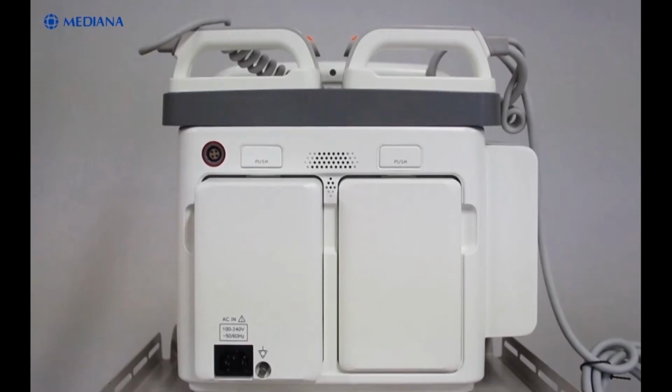Now we will go through the power supplies and how to use them. You have 3 different types of power supply: AC power, DC power, and battery. First of all, for the AC power, make sure that the AC outlet is properly grounded and supplies the specified voltage and frequency. After you plug the male-type connector end of the AC power cord into a properly grounded mains outlet, please verify that the battery charging status LED and AC/DC in LED on D500's front panel is lit.